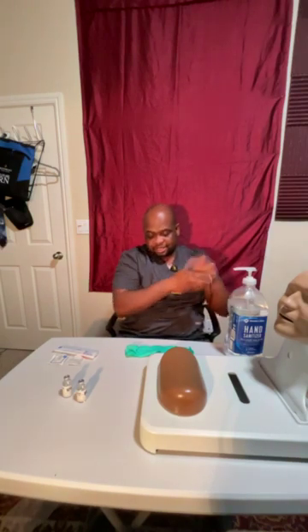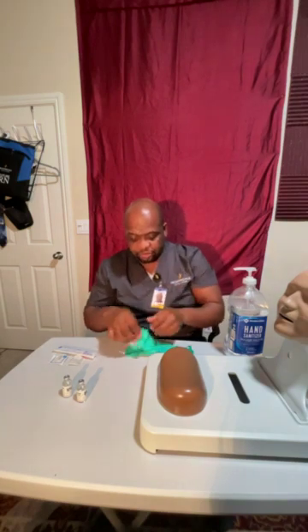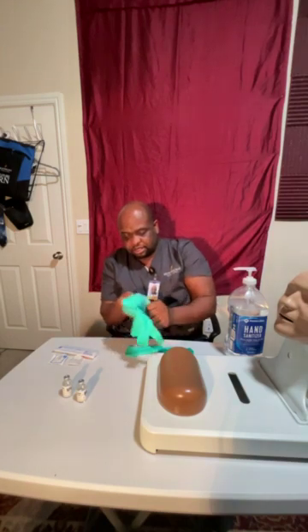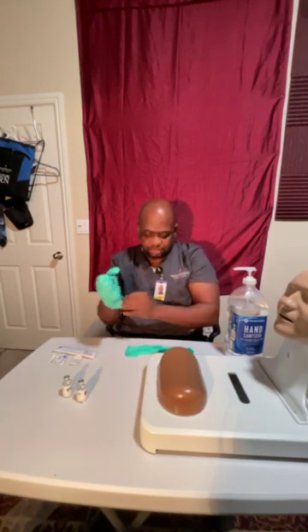So I'll do hand hygiene again. And then I am going to put on my gloves. It's already confirmed that the medication is not expired, so that's good. Let's see here. I have my fellow nurse here, Nurse Agnes, right next to me.